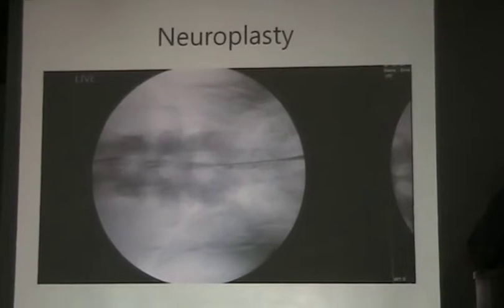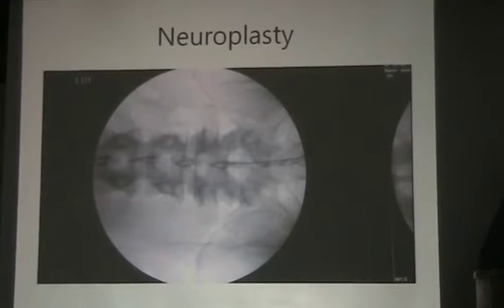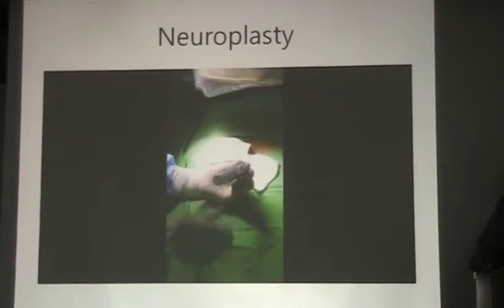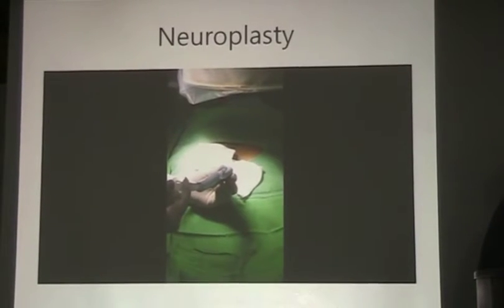To amplify distal space like this. And inject the contrast to identify the location of the catheter and make mechanical lysis or chemical lysis with solution. Yes, this is solution injection in cocktail.